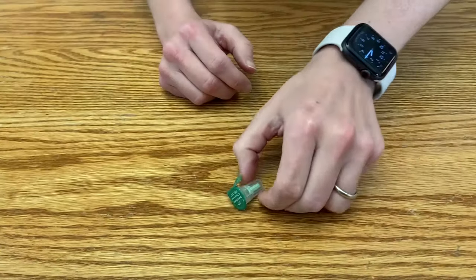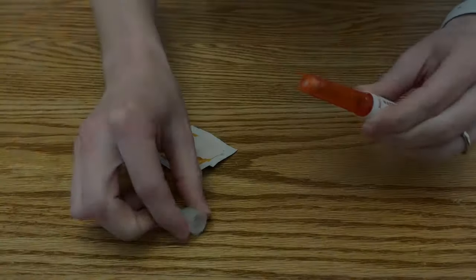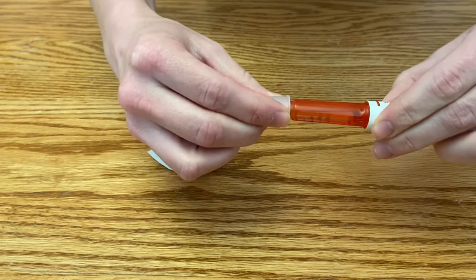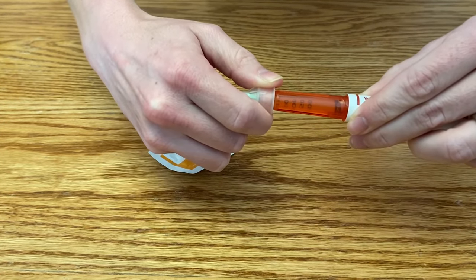Next, we're going to connect the pen needle. To do this, peel off the paper tab. Then place the needle straight onto the pen and twist the pen needle on until it's secure. It doesn't need to be overly tight, just secure.